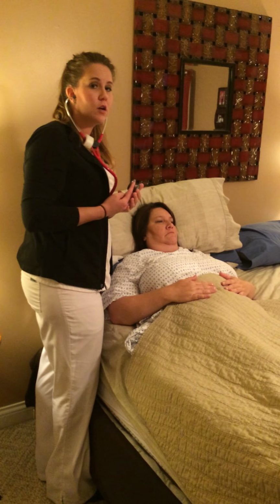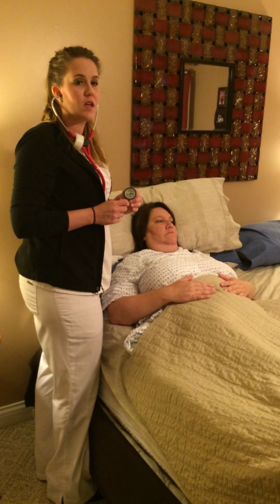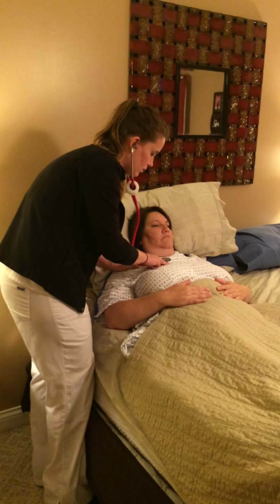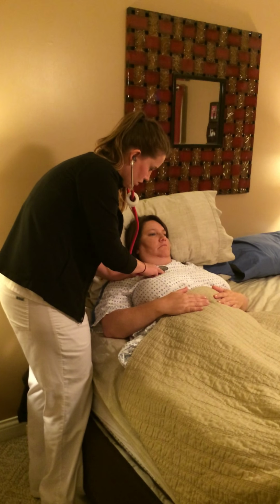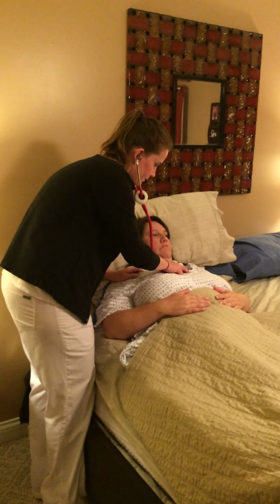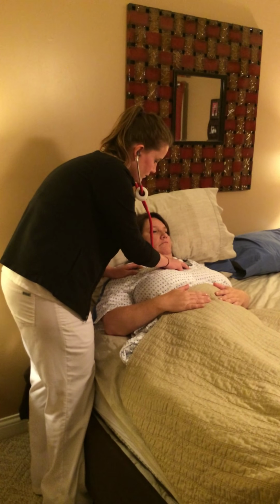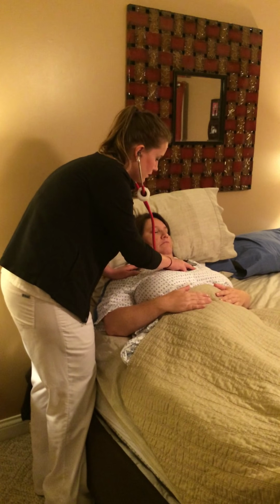You can more adequately hear S3, S4 sounds with the bell of your stethoscope. So I'm going to switch that over and go back to the right side and listen to the second intercostal space for those. I'm going to go to the third intercostal space.